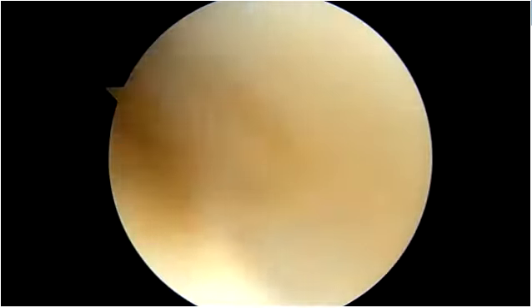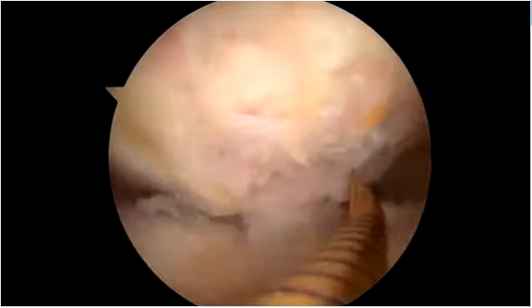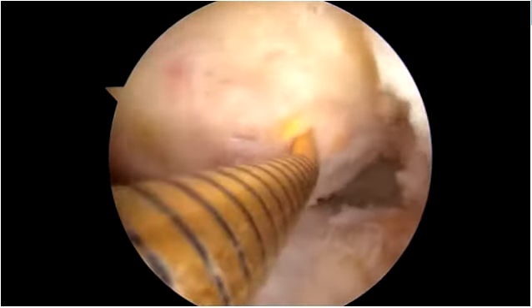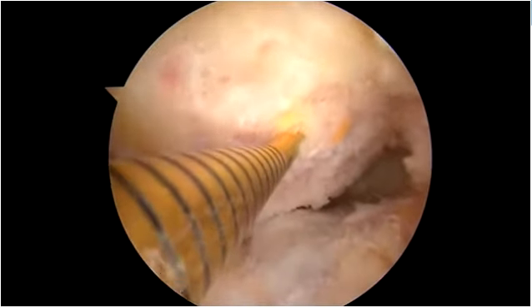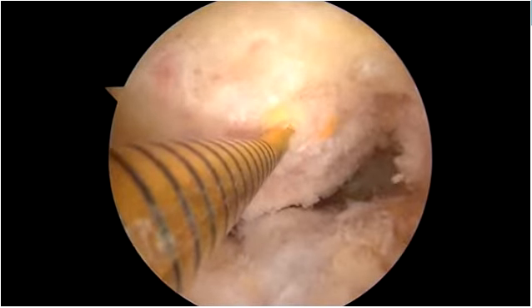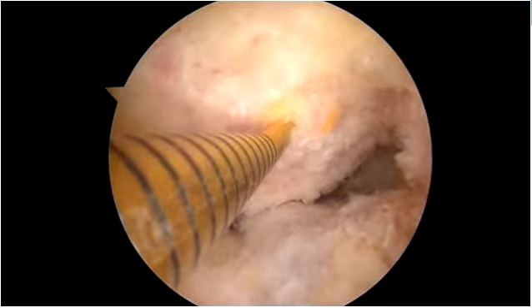Sure. I'm going to actually do that with the microfracture awl, Rob, and we'll take some fluoroscopic images. If we get this in. Okay. So, for me, this is the footprint. And let's just take a fluoroscopic image. This is where I think the ridge is. So can we see the floor? And as Roman was saying, notice if you follow the posterior cortex and that sort of arch down, you can see that that's where the ridge starts.